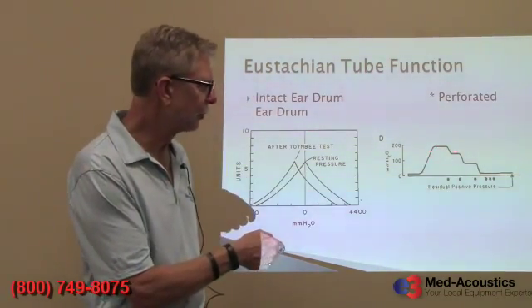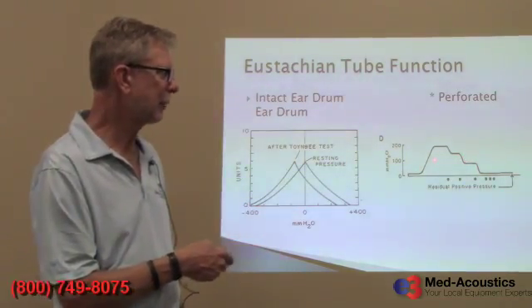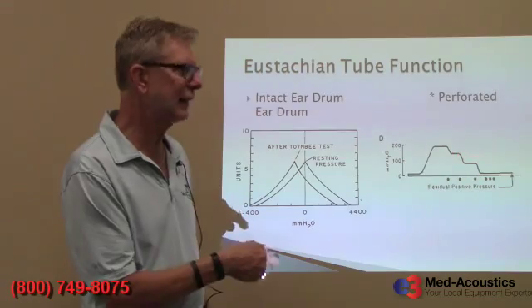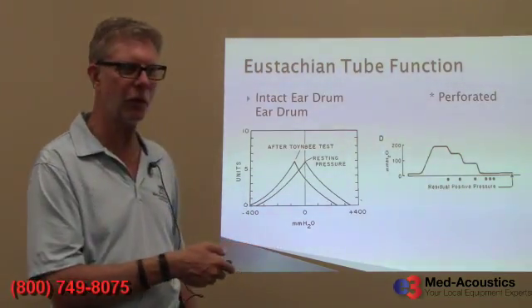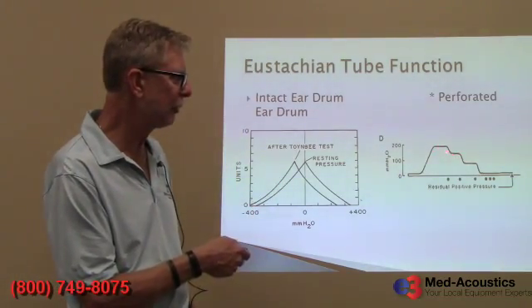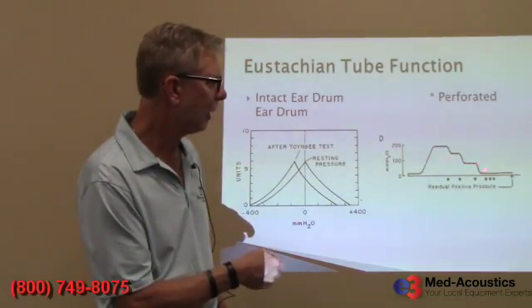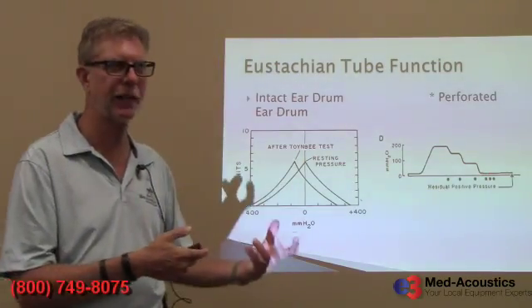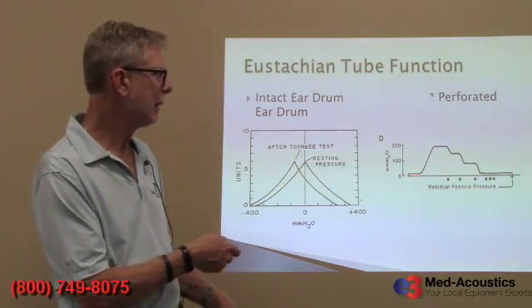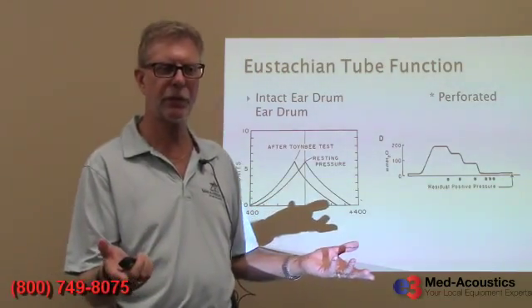And when it does, it'll drop down like this. Okay? If we kept on going, it might drop down a couple of times. You've got to make sure you don't have a false negative here where it simply leaked out, and that's why it looked like the Eustachian tube opened. You have to have a good positive seal that maintains. But if you do, you can actually push the Eustachian tube open and the pressure will drop. And when you see it drop, here the patient might have been drinking water and taking a couple of gulps and was able to get it to drop several times. I say if it drops once, you've pushed the Eustachian tube open, and if you can do that at least by the time the pressure gets to 400 decapascals, then you have a good Eustachian tube.